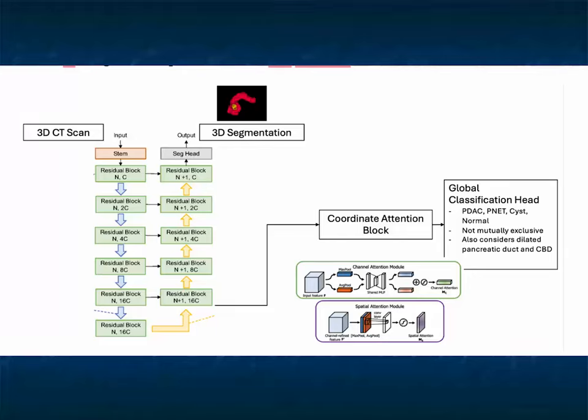So now what you need to do is say, okay, we can find the pancreatic gland. We can use radiomics. In select cases, we'll do cinematic rendering, but typically not in those early cases. We're not sure how well it works, but something to look into. But what about AI?